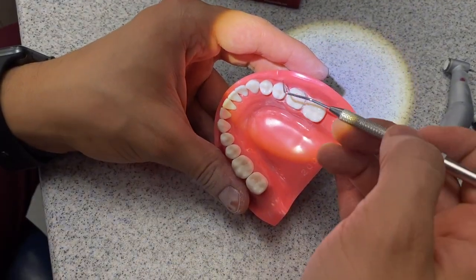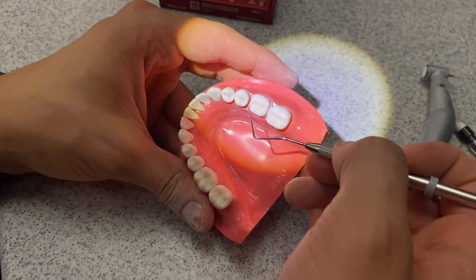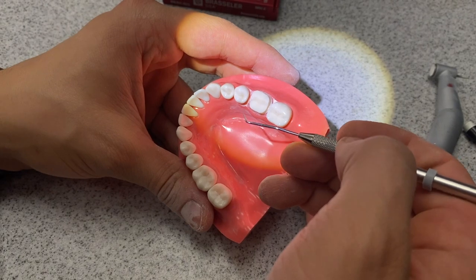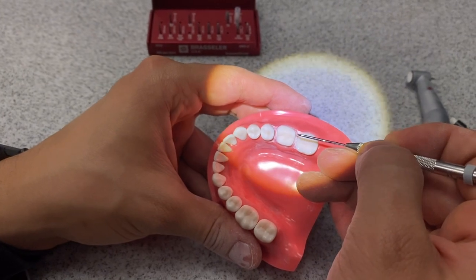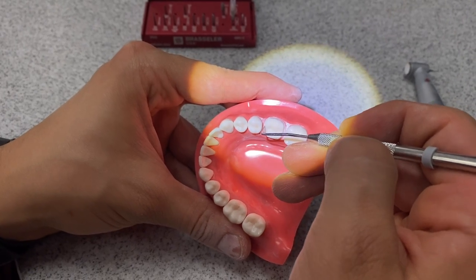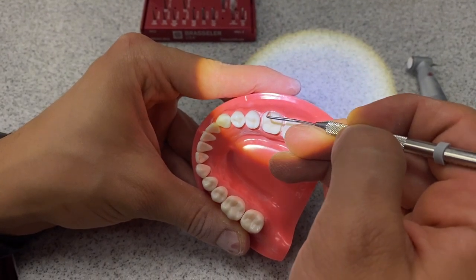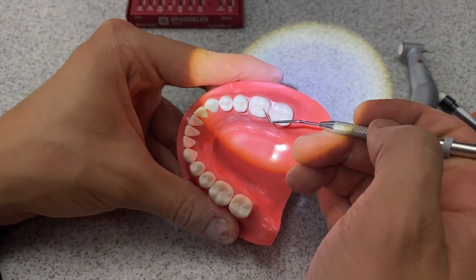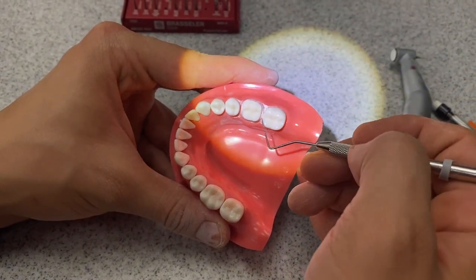Now we've done essentially the gross reduction of this tooth. Now it comes to refining the prep. This is where self-assessment is going to be really important — being able to analyze your own preps to determine what could be improved. For example, I know that my line angles need to be really well-rounded, and I can see that it's a little bit bumpy here — there might be a little bit of an undercut. All my axial walls need to be smoothed out a little bit more. We're also going to be checking our occlusal reduction with our matrix to make sure we're at the appropriate depths. To do this refinement, I'm going to switch my burr from the 1 DT to the 1 DTF.